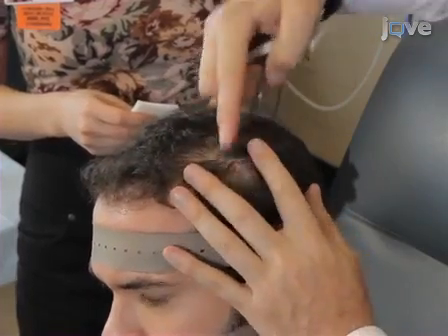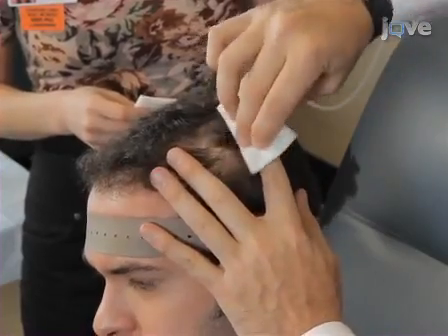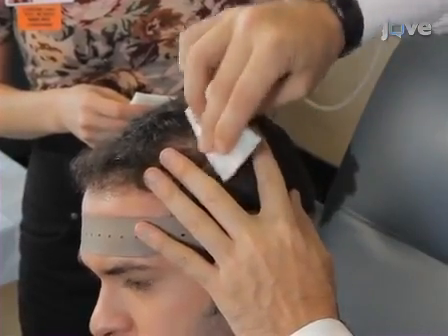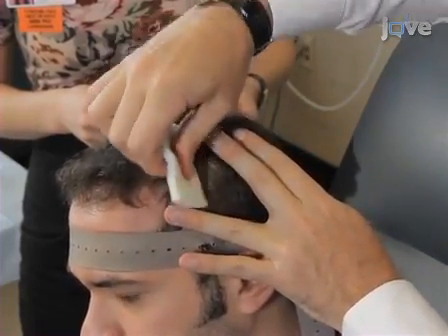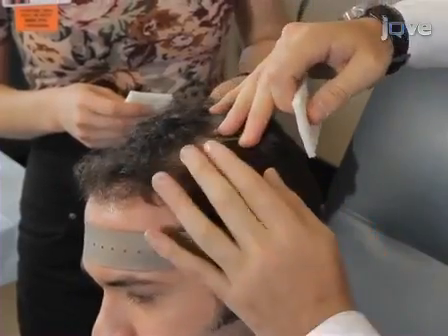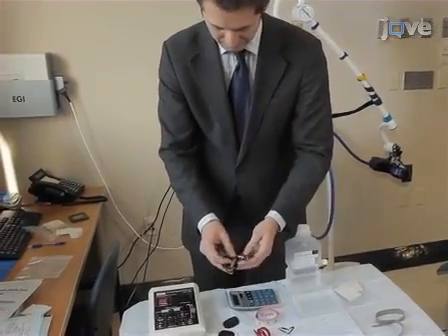Now, inspect the skin where electrodes will be placed for signs of irritation before preparing the area for electrode placement. In case of any visible lesions, do not apply TDCS in this area. To increase conductance, move hair away from the electrode sites, clean the surface of the skin, and allow it to dry. Next, connect the electrode cables to the device.